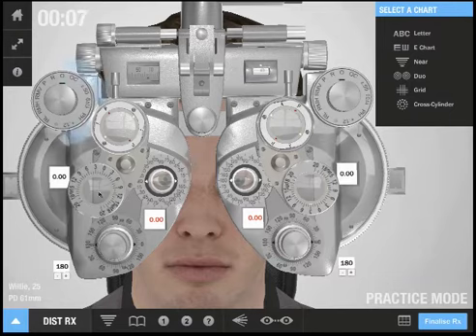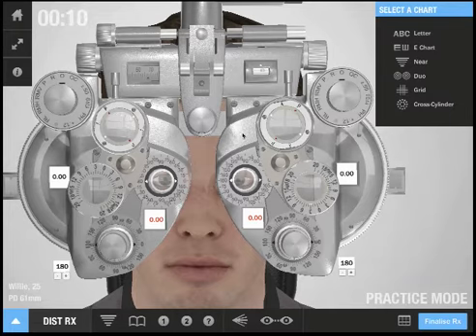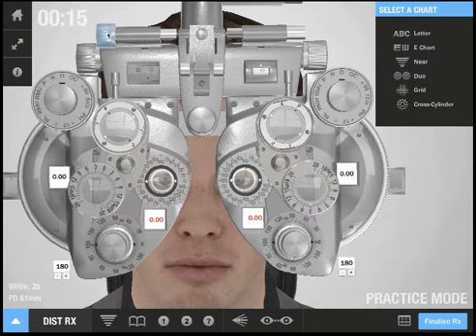One side of the phoropter is very similar to the other side of the phoropter, so I will just explain one side. Starting from the top, up here I can adjust the angle of the phoropter.